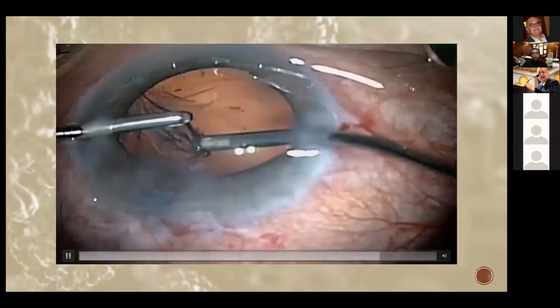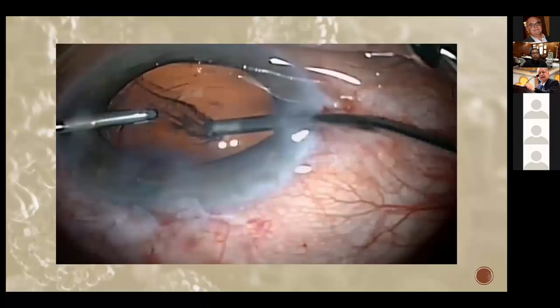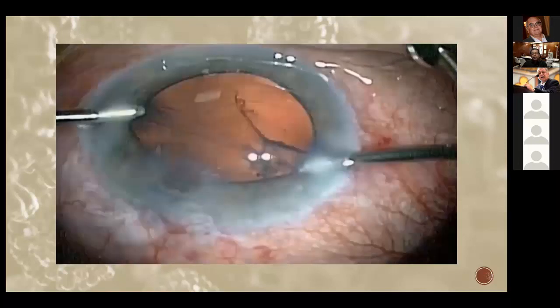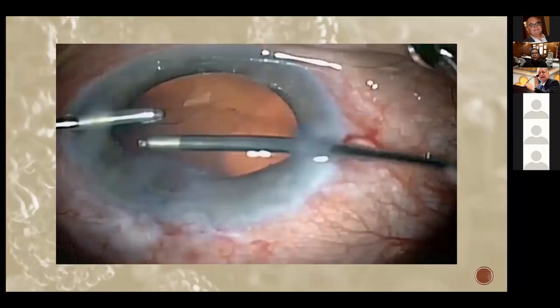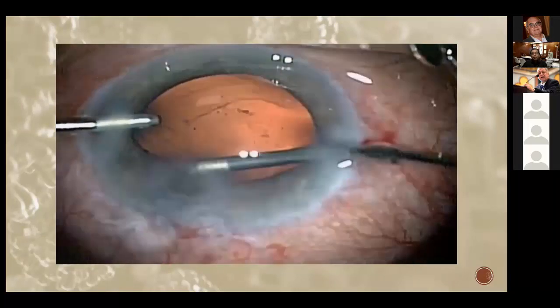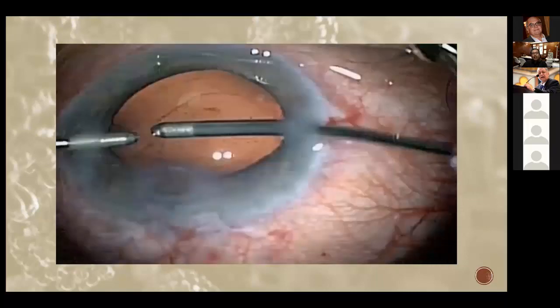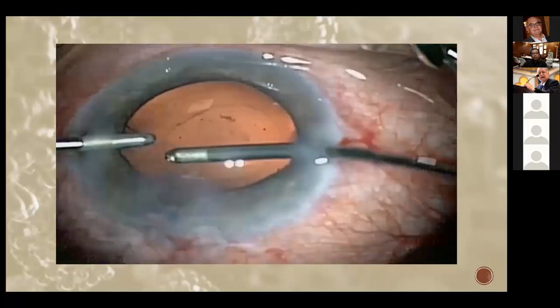You are always faced with two choices: either to put it in the middle of the surgery, at the end of the surgery, or at the beginning of the surgery. At the beginning of the surgery, you are making sure that you don't lose the zonules and you don't reach a stage of the surgery where you cannot put your capsular tension ring. It gives you more confidence in your surgery. But as you can see, you are faced with lens matter that is entrapped in the capsular tension ring.